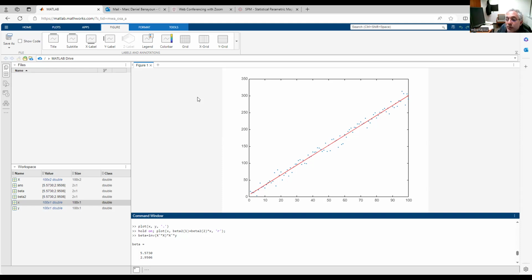And then if I turn it down really far, I could even set it so stringently that I lose all the voxels that were really bright in Wernicke's area anatomically that I see on the image. So I also have this ability to just visually look and see, as I'm changing my alpha value, when I'm gaining stuff that looks completely nonsensical and when I'm losing what looks like pretty accurate, high statistical likelihood areas that match all the a priori knowledge I have.